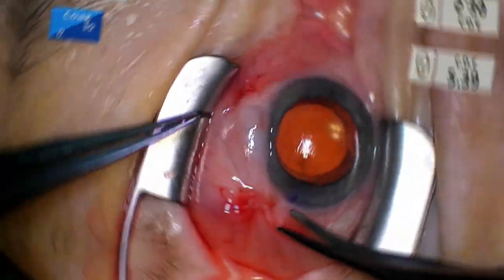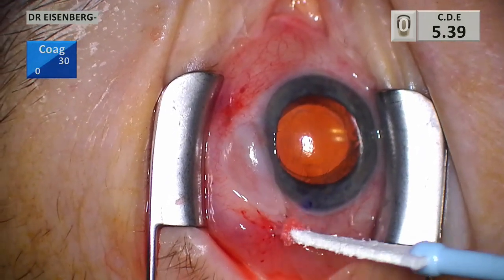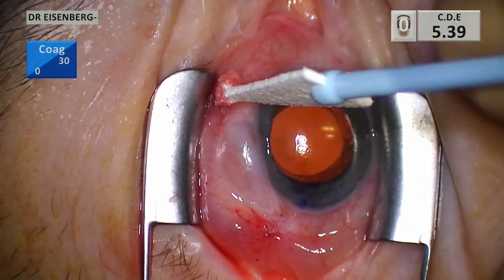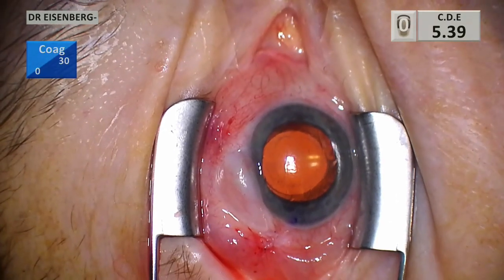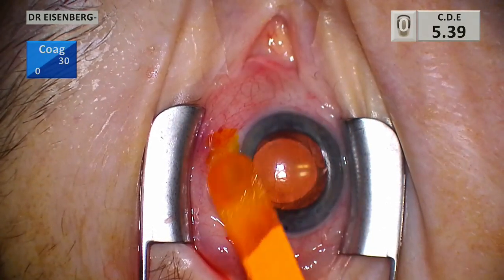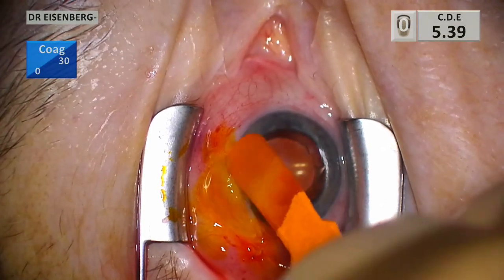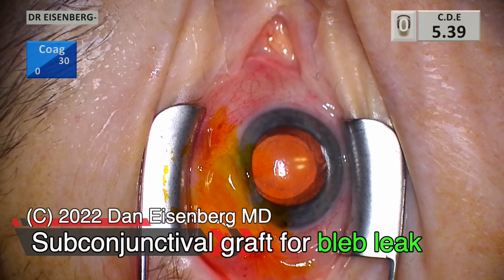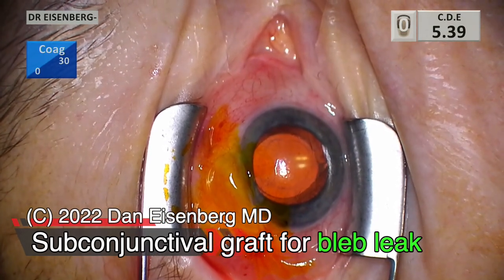Over the years I've done many of these, and this is what they look like — pretty much the same as where we started, with one exception: the leak is now sealed, or will seal within the next several weeks. It doesn't always seal immediately; you can give it up to a month or more. And there we have it — subconjunctival amniograft for the bleb leak. Thank you so much.